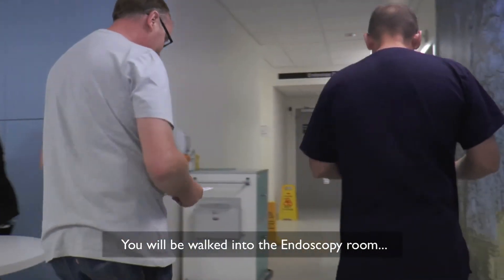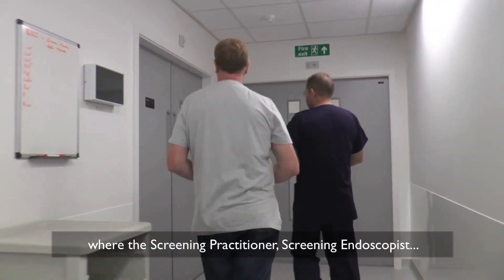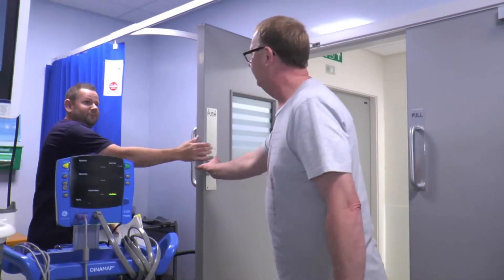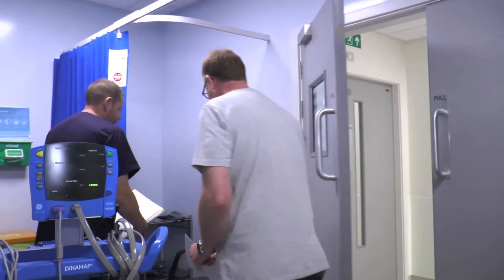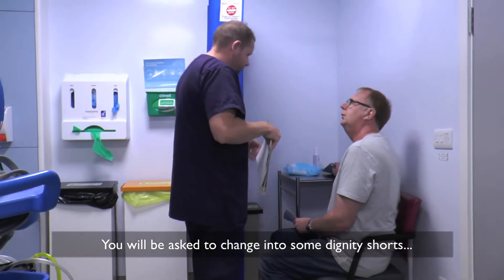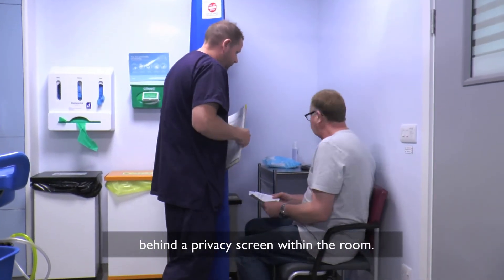You will be walked into the endoscopy room where the screening practitioner, screening endoscopist, and endoscopy nurses will be present. You will be asked to change into some dignity shorts behind a privacy screen within the room.